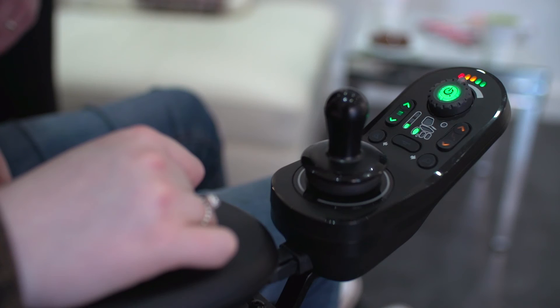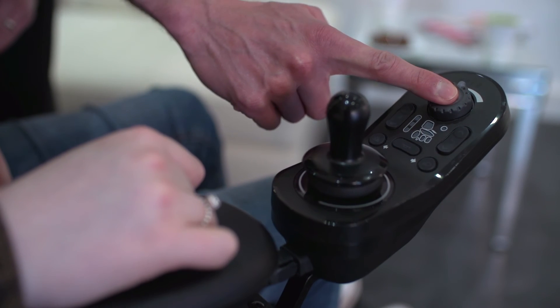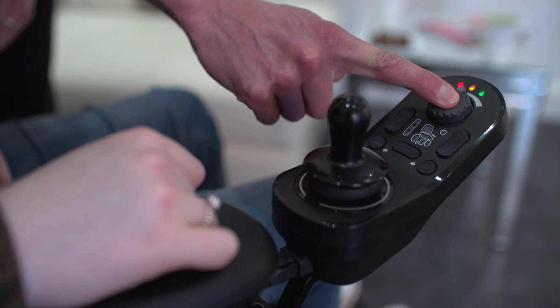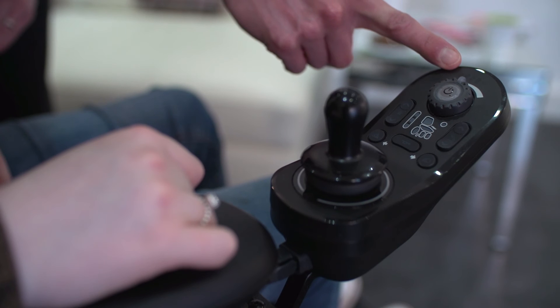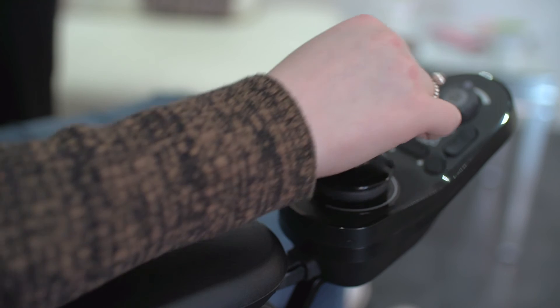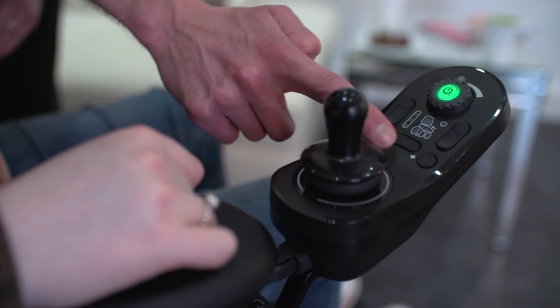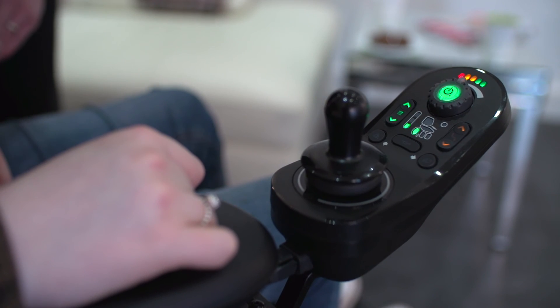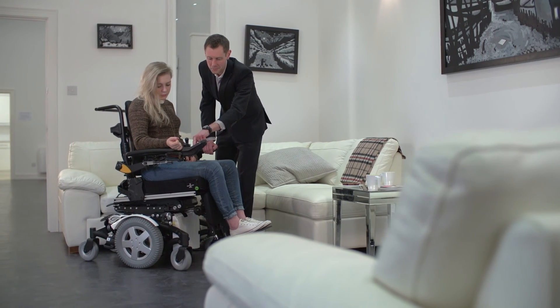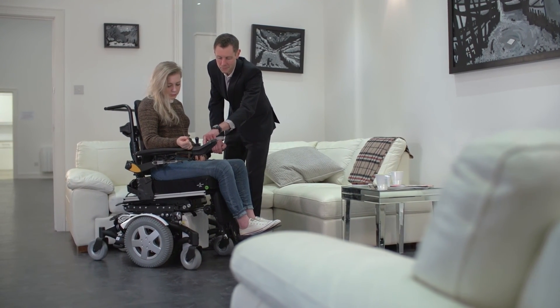The keyless lock function can be activated by holding the on-off button for over 4 seconds. The left, centre and right battery LEDs will flash to show the power chair is in lock mode and the joystick will not operate. To unlock, simply turn on the remote and press the horn button twice within 10 seconds. This is a programmable feature so can be disabled by the power chair provider to suit the needs of the user.